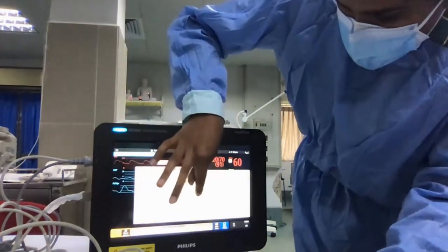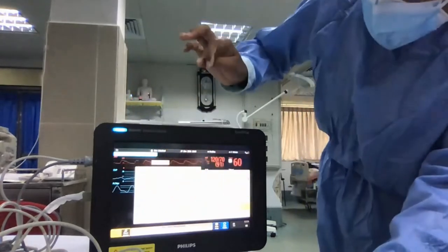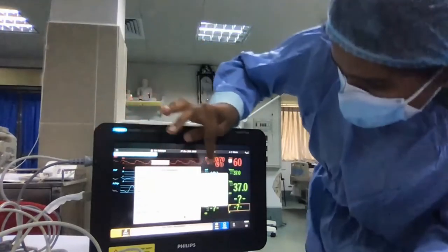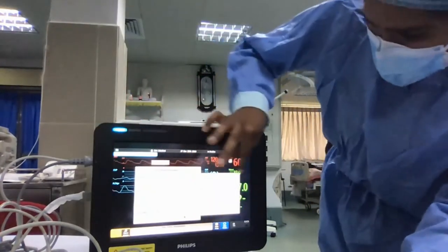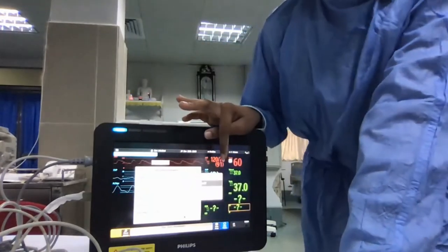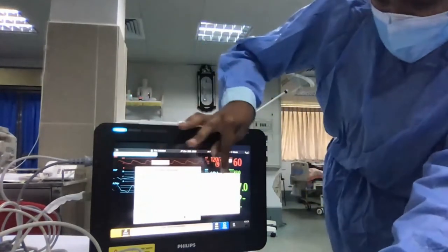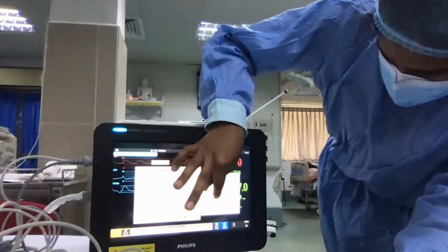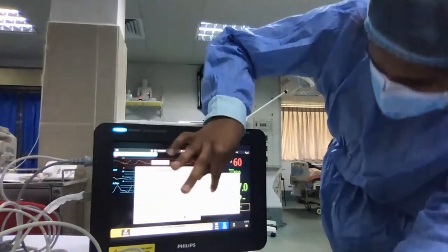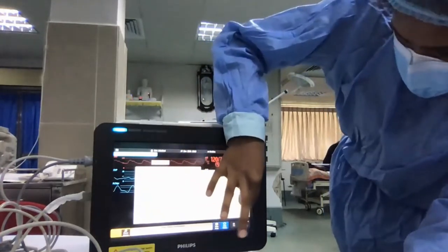Name of the patient. Enter. First name. Enter. MRN is the bedhead number. Enter. Then gender. Date of birth, enter. Paced mode is whether the patient is using an internal pacemaker or not. For the moment, we'll keep it as off. Then height. I will put something around 153. Then weight. 62 or something. Then any special notes on the patient, enter.